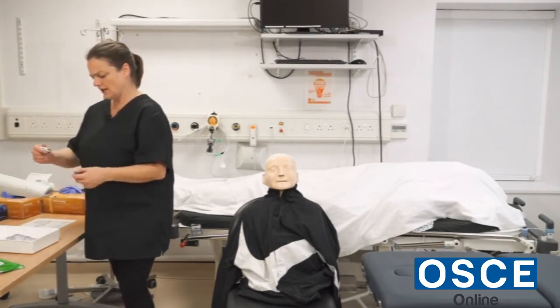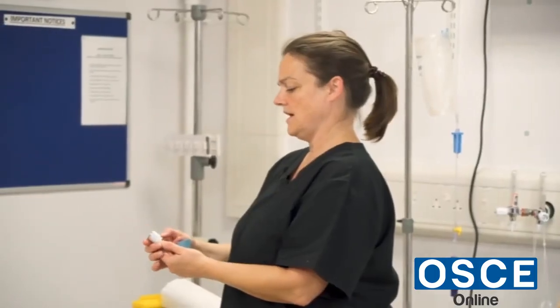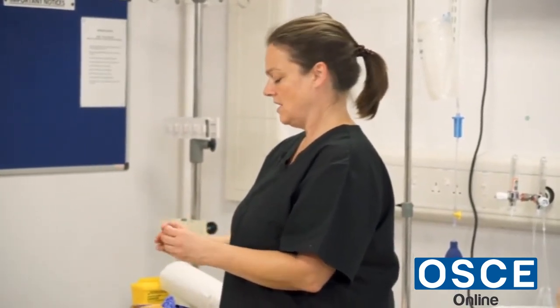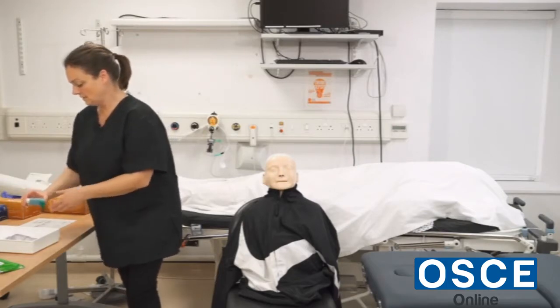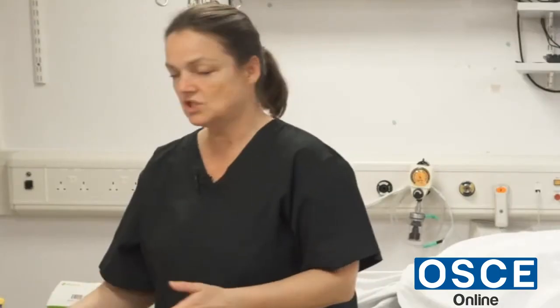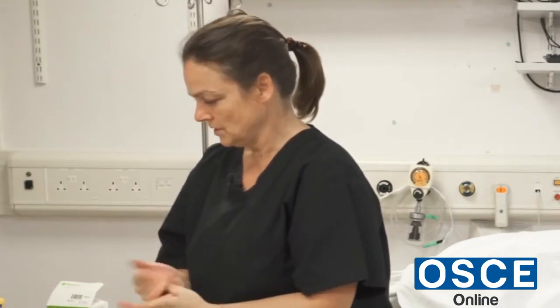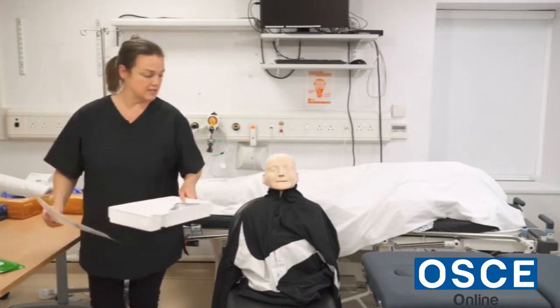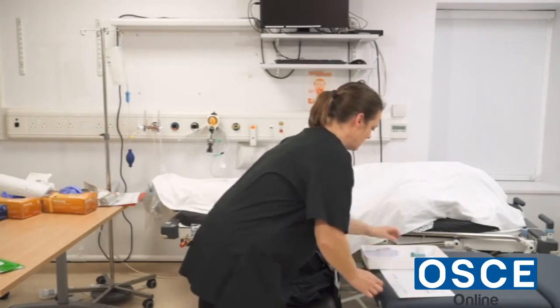And I'm just going to check this closely. It says it's salbutamol, and it says it expires in 2023, and it's intact. I'm happy to use that. I would gel my hands again. So I'd go back to the patient now and explain the procedure. So I'm back again, Peter.